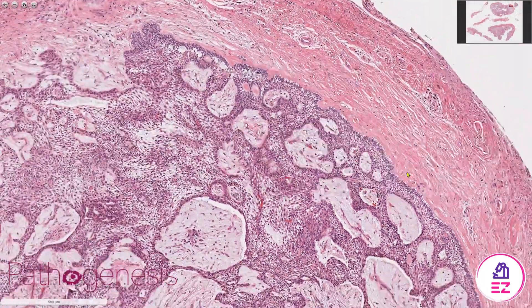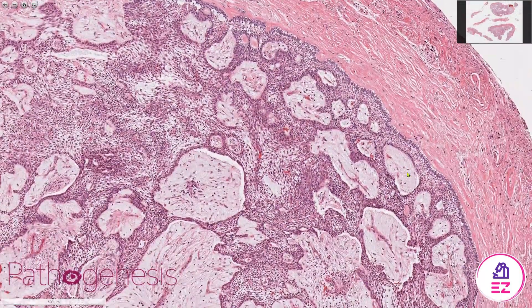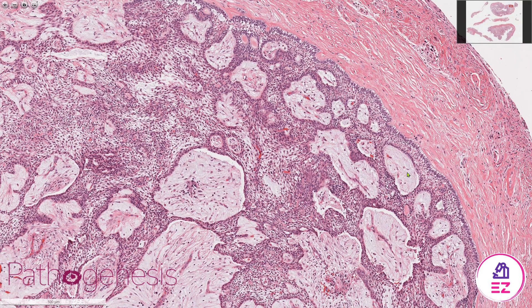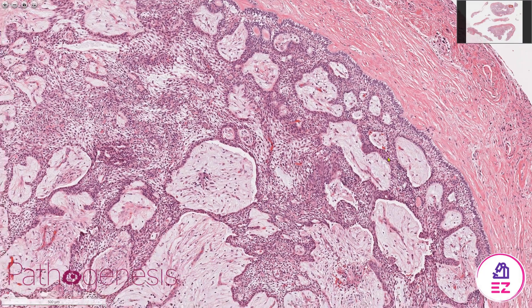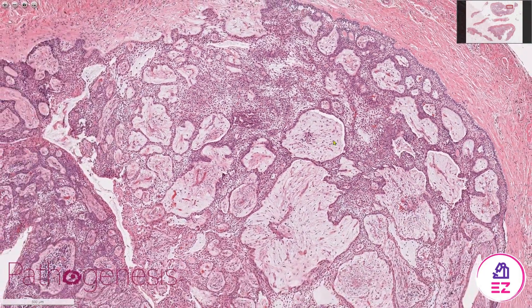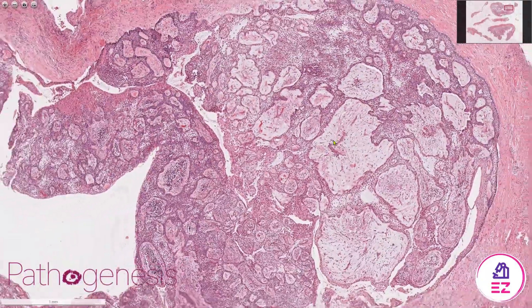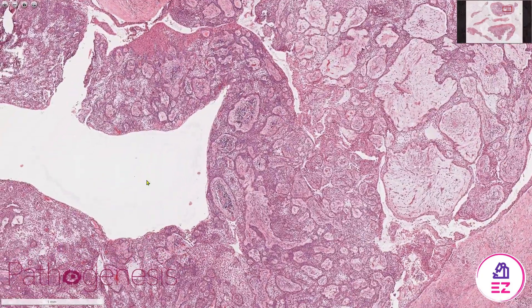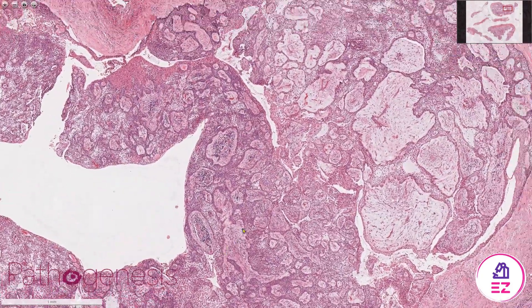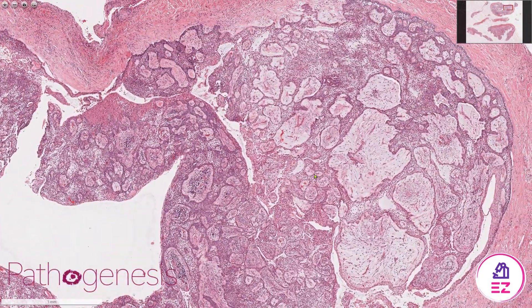This particular unicystic ameloblastoma is the intraluminal type. There are three variants: the luminal, intraluminal, and mural. This is intraluminal because the lining has proliferated into the lumen of the cyst, as you can see here, in almost a plexiform pattern.